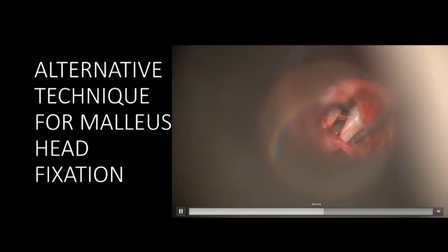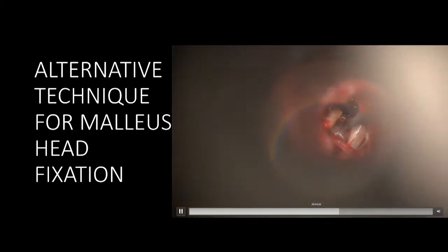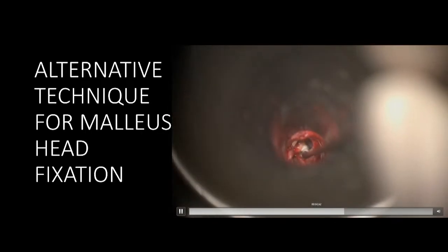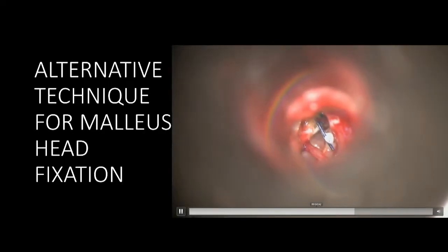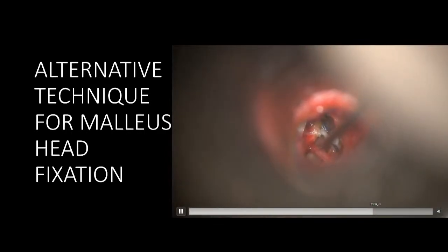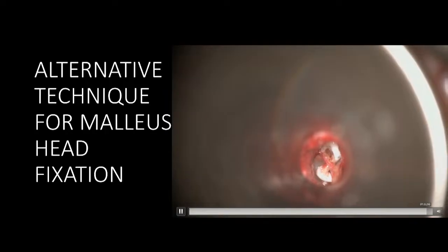There was almost like a little triangle of malleus and a triangle of incus just touching. Remember, I have separated the incus joint, so we're not putting any extra tension on that stapes. And then we glued them together there. Again, in true form, we had to do a nylon strut. So that's in there, a little nylon strut across. Glued that together, and then went back and reinforced the stapes joint. I think that was probably unnecessary, but just to make sure.